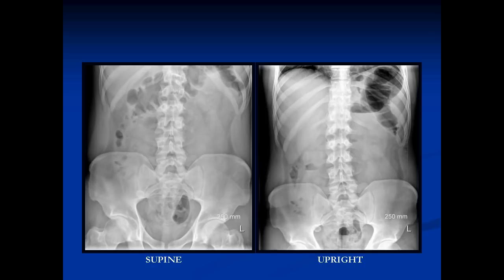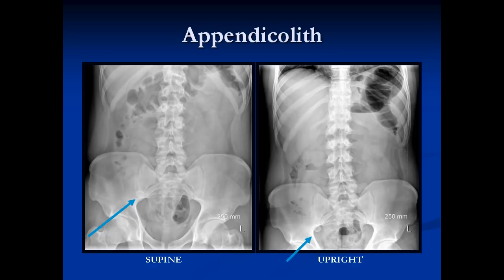Here we're looking for a calcified structure in a 16-year-old boy with pain around his umbilicus that subsequently moved to the right lower quadrant — we're looking for appendicitis. On the plain film we see a calcified structure called an appendicolith. These are not a frequent finding; the best test for appendicitis in a young thin patient is ultrasound. However, whenever you see an appendicolith in the right lower quadrant, it's considered an important finding, and most of these appendices are removed prophylactically — elective surgery is used to take out the appendix even without proven appendicitis.